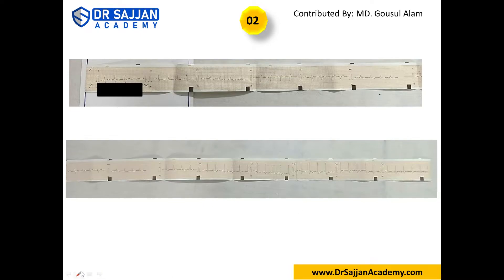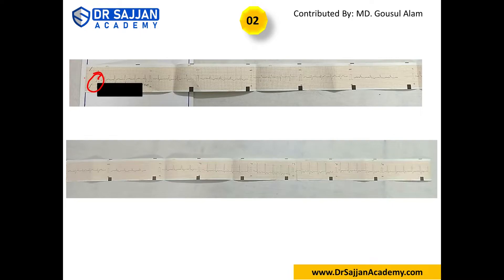Let's go systematically. First is standardization — again it looks okay but not exactly complete. Lead AVR — looking at AVL, AVF, AVR — there are slight changes in AVR. Not so clear, but assuming it is inverted: P wave, R, and S are here, so it looks reversed. Rhythm: we don't have a rhythm strip here, but looking at lead one, the distance looks equal, so rhythm is regular.